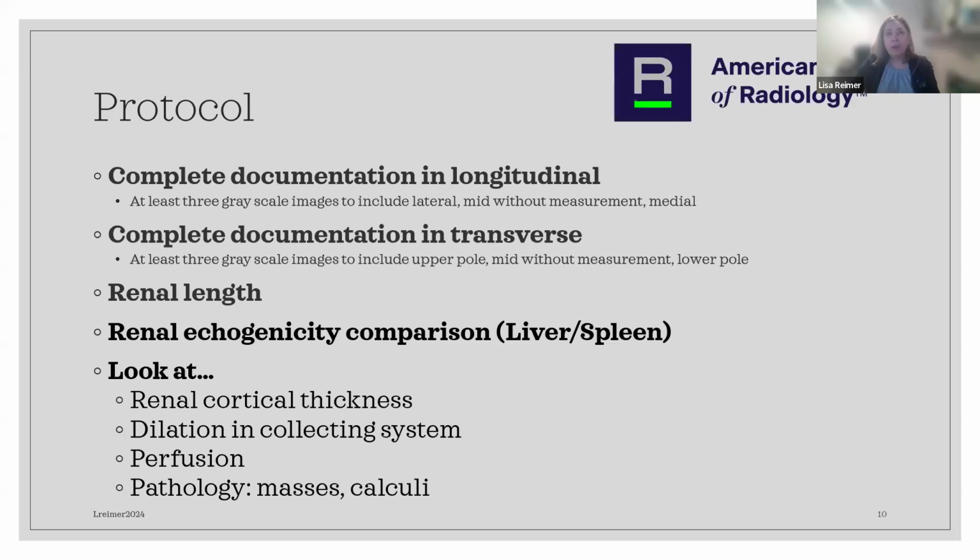The reason I share this slide with you is because protocols, I think in general, are important for a few reasons. One, they help with consistency. So if you're following someone else's work and they're doing the same protocol, it makes it easier. And ultimately outcomes for the patient are better. If everyone's measuring length and everyone's assessing echo texture, we know if there's a change. We know that it's more likely that a change has occurred.